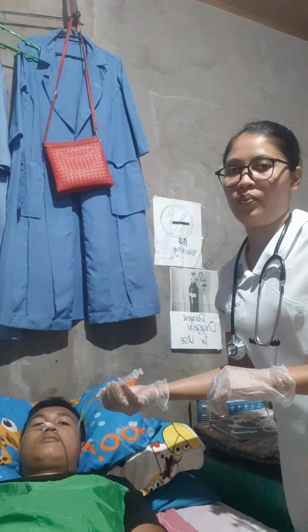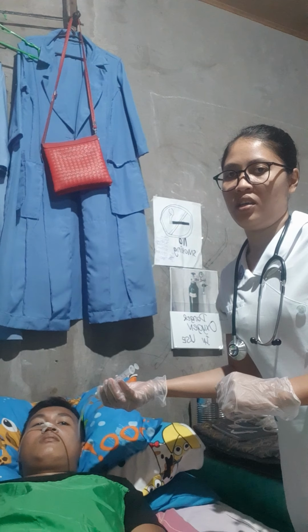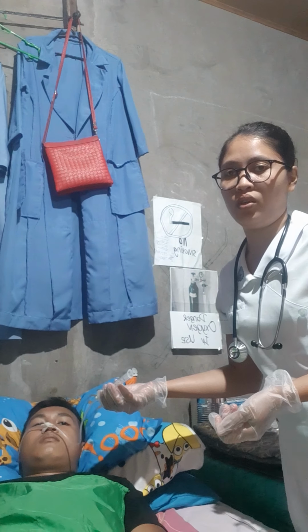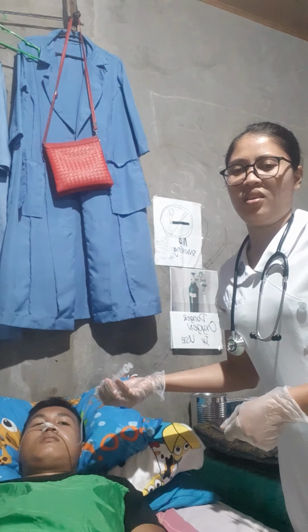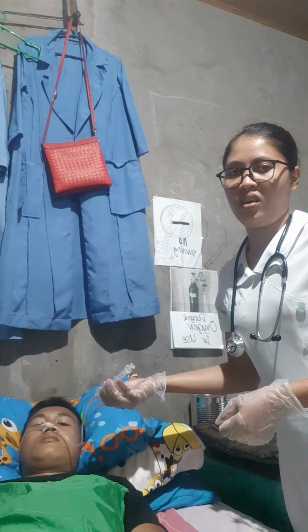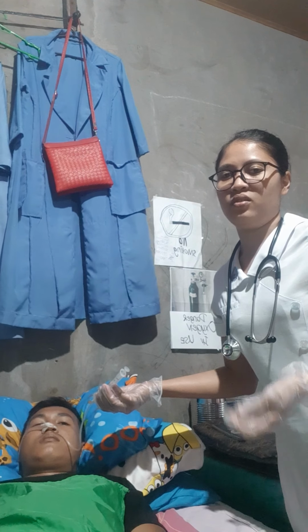So the precise amount is usually determined by the care provider's order, or by the hospital's or institution's policy, because at some agencies or institutions, feeding is delayed when the specified amount of the formula remains in the stomach.